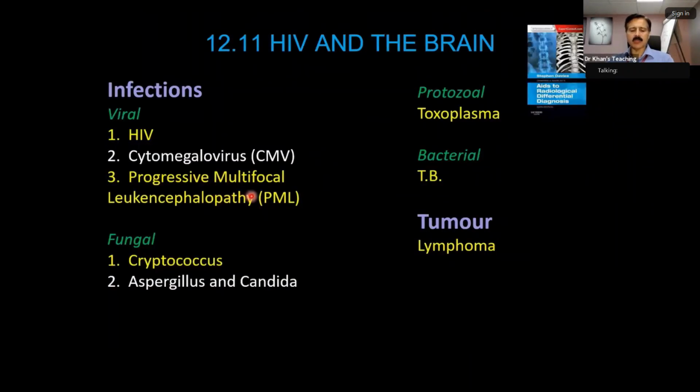PML is very important because in PML, we will come back to PML shortly. So I'll tell you about PML on a film. Secondary infections like cryptococcus is an exam case. It has got a unique finding, which we will learn.